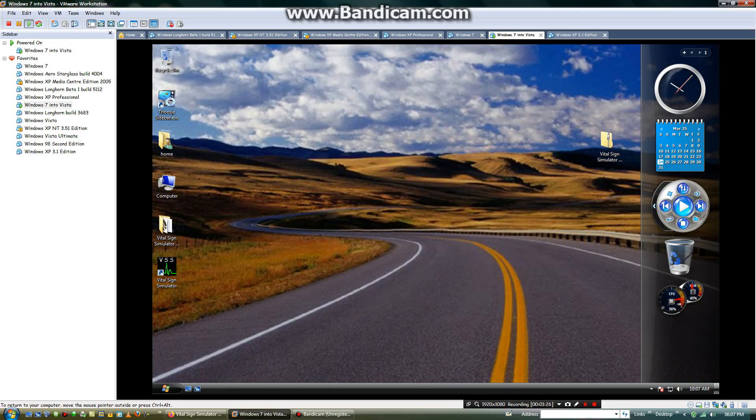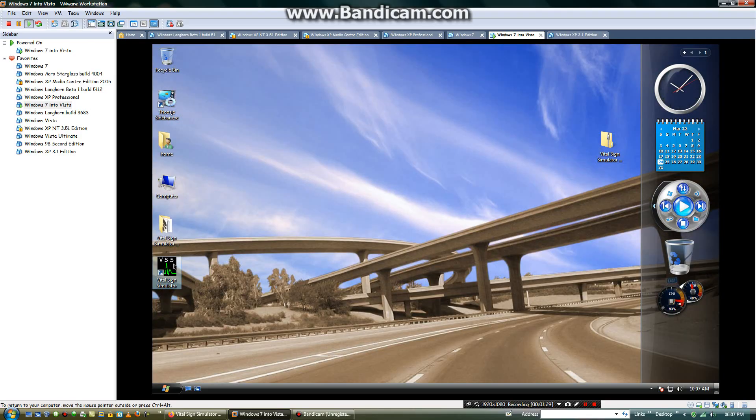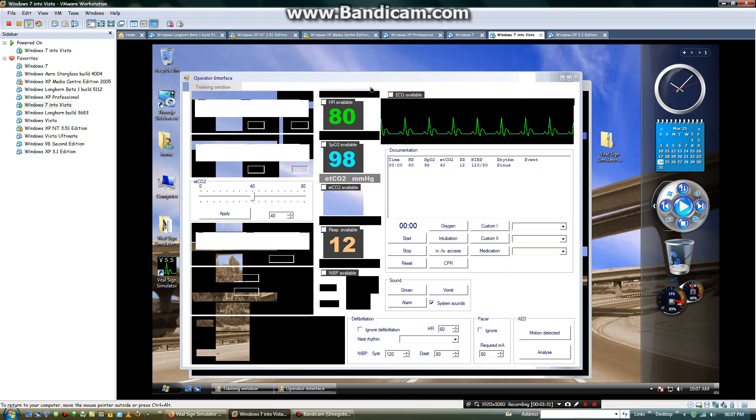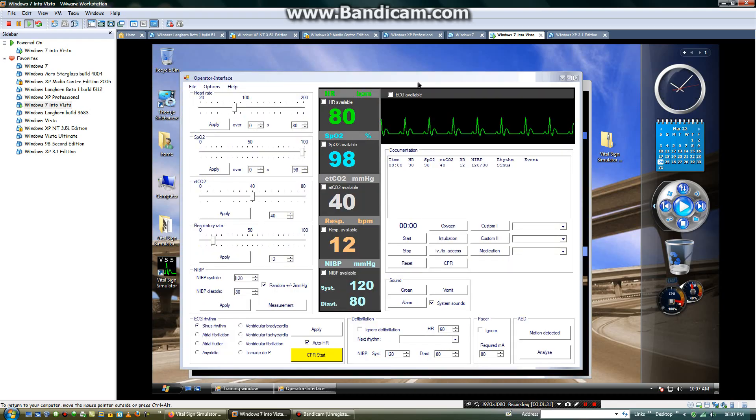When you are done, close this window. Then launch the Vital Sign Simulator software. Now this window will come up.